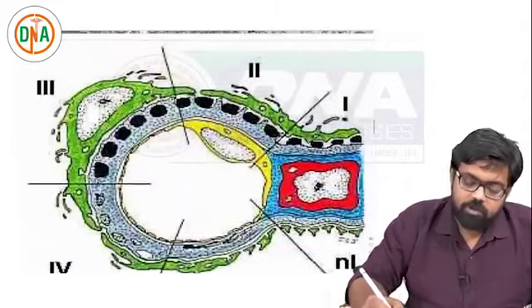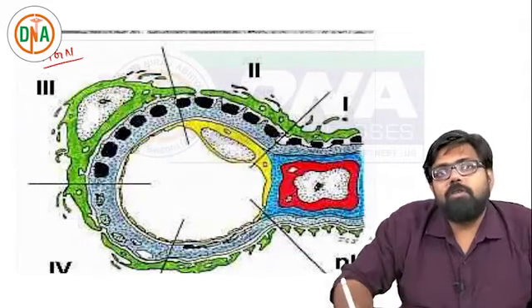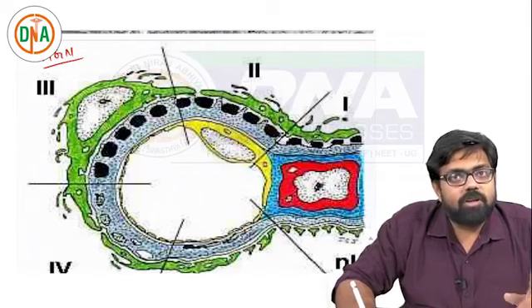Next we'll be discussing membranous glomerulonephritis. What I told you is that it happens in stages. Let's have a look at the sequence.